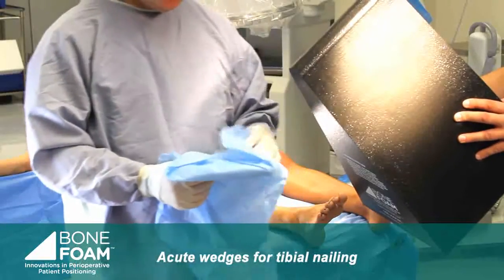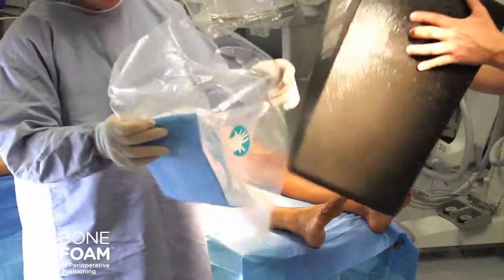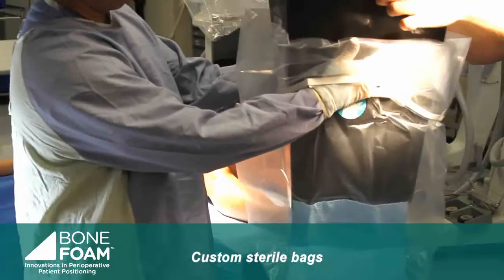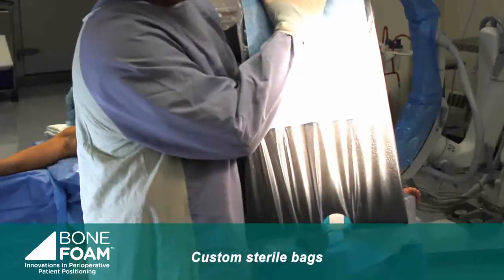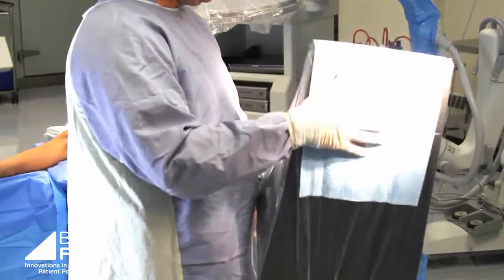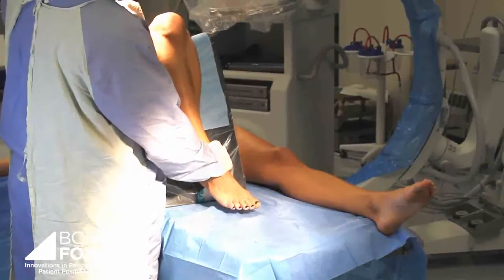This can be brought onto the field because we have these custom bags into which the pieces can be placed. So you see how these just drop in as an inverted triangle and are maintained? The custom bag has this durable cover at the apex of the triangle. Again, quite stable, and the knee is allowed to sink into the acute triangle, providing stability.